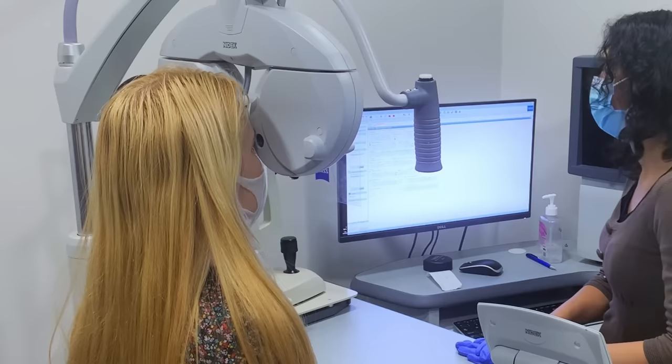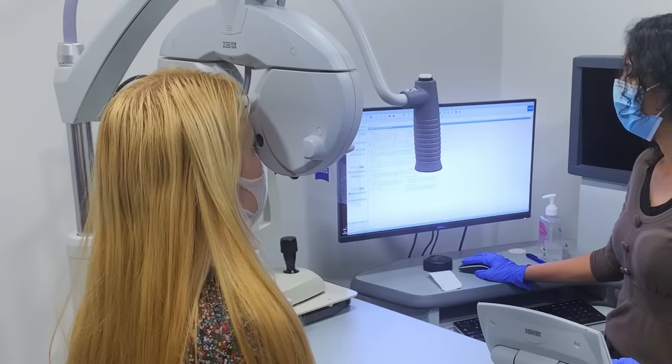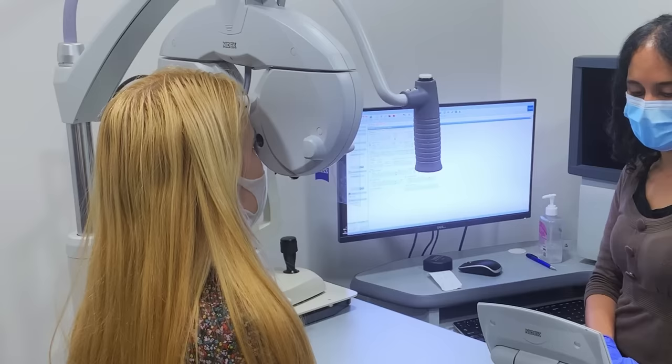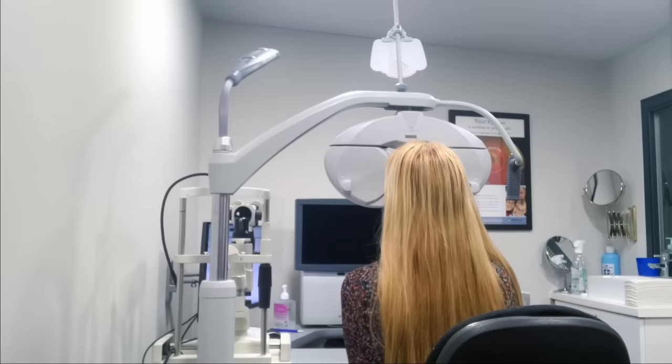It might feel a bit strange, but if you can try to keep both eyes open for me. If you look back over to the middle line, is that middle line clearer with number one now, or clearer with number two? Number one. Okay, good. And between number three now and number four? Number three. Okay, good. And between number one now and number two? Number one. Okay, great. If you have a look at the numbers on the red and the green, which stand out more to you? Which look clearer, the numbers on the red or the numbers on the green, or are they just the same? I think the red. Okay, great. And how about now? They're about the same.